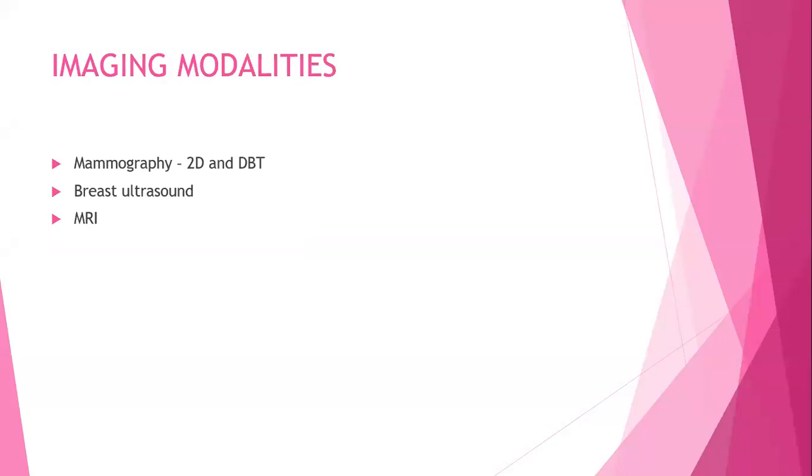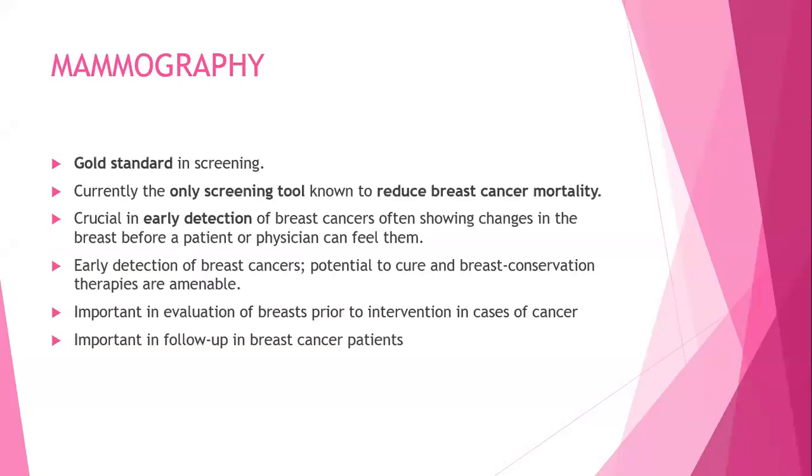For imaging modalities, we mainly use mammography, the standard 2D mammography, or the 3-dimensional mammography, which is digital breast tomosynthesis. The other modality is ultrasound, as we have alluded to, and MRI. These are the modalities we usually use for diagnosis of breast cancer.